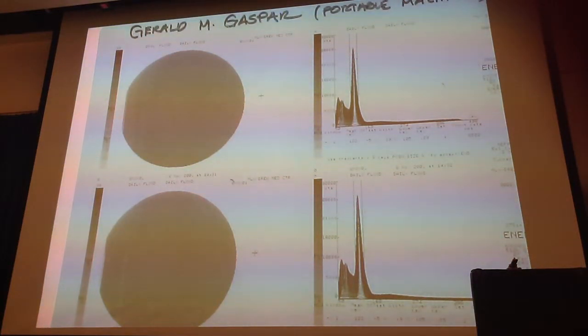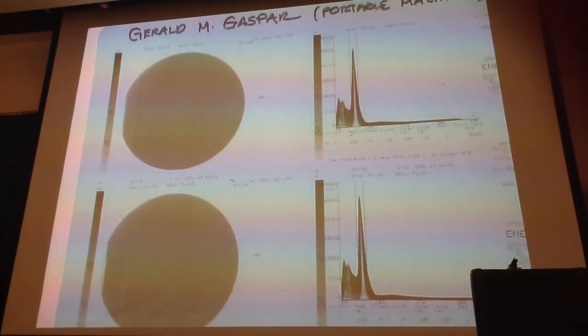Now, one of the other types of uniformity, okay, again, if you're doing intrinsic and extrinsic, there are some things that you have to be concerned with.